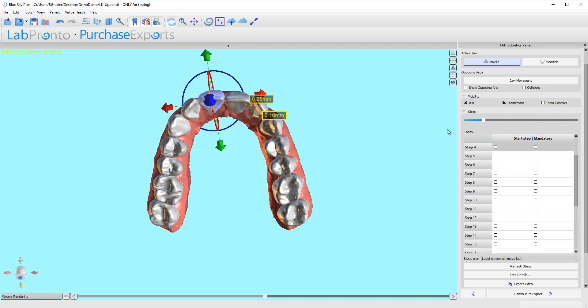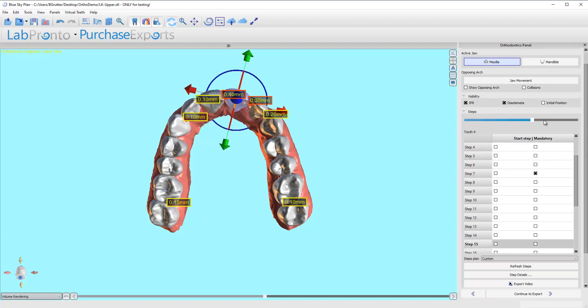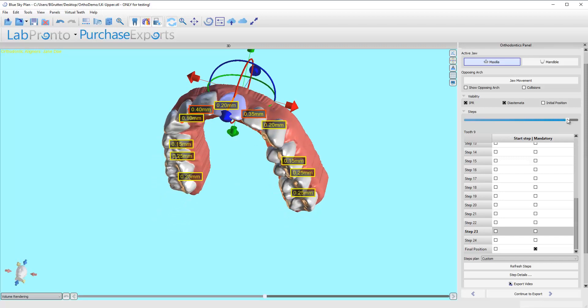The first thing I can do is say, this tooth worked a lot better when it started moving right away. But right now its start step is listed at step 19. Why don't we just tell it to start moving at step 1? That would make things pretty nice. I'm going to refresh steps and see what happens. It starts moving right away, and it really helps. Now the worst it gets is 0.35, and I can fix that as well.